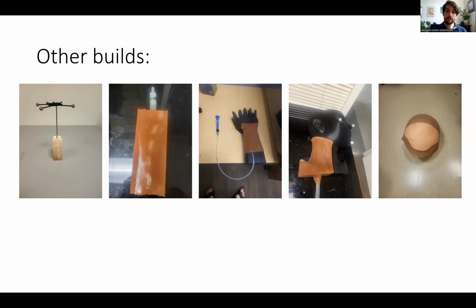Another one is doing arterial lines. So all the vessels you saw so far were venous in that they're low pressure and aren't going to shoot back at you. But what if I want to have students be able to practice on an arterial line? So I just connected a tube with a syringe I can squeeze to the vessel. And voila, you have an arterial line.